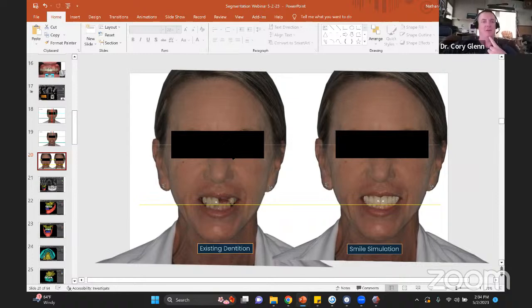I have tried to do the intraoral scanning of the face. In fact, I've often argued that you don't need the whole face. You really need button of the chin, the teeth, and up to the bridge of the nose. And that's going to be enough to set your midline. I don't know if it's changed, but what I ran into that made that problematic is that now the scanners are smart enough that they know we're looking for teeth. So even though I captured it all in my scan, when I then processed my scan, it cut all that out because it saw it as extraneous data.